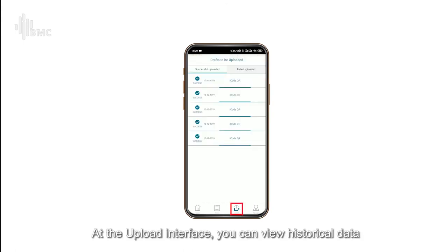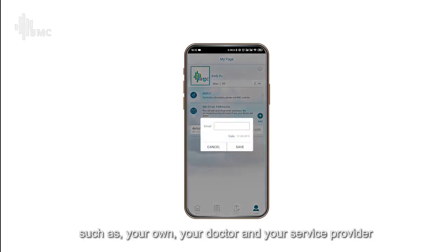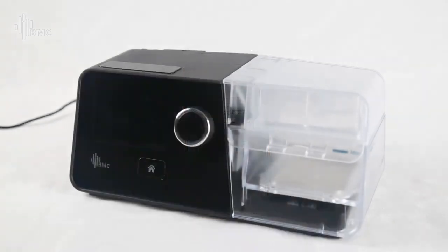At the Upload interface, you can view historical data. At the My Page interface, you can set up 3 email addresses to receive reports, such as your own, your doctor, and your service provider. These reports can be shared at every QR code scan.